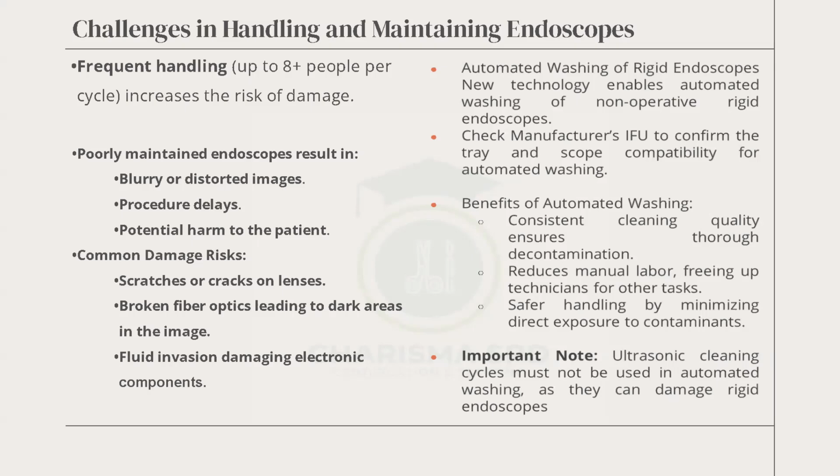And then important notes. Ultrasonic cleaning cycle must not be used in automated washing as it can damage endoscopes. So please do not put your scopes in the ultrasonic machine.